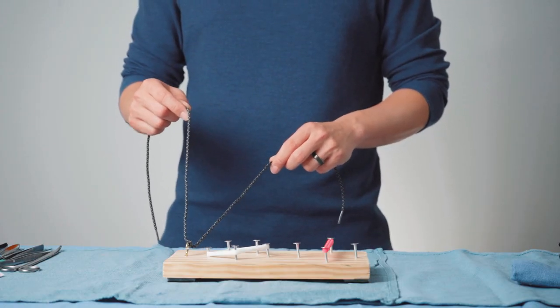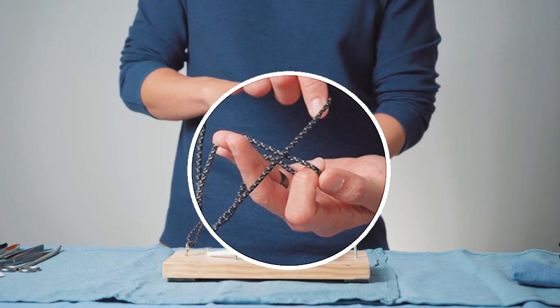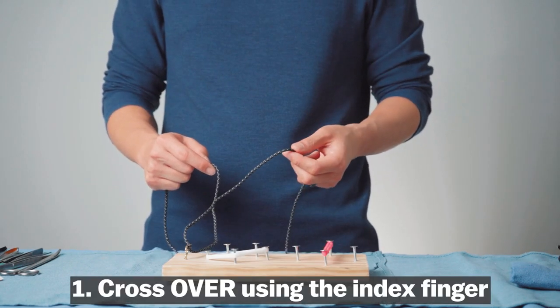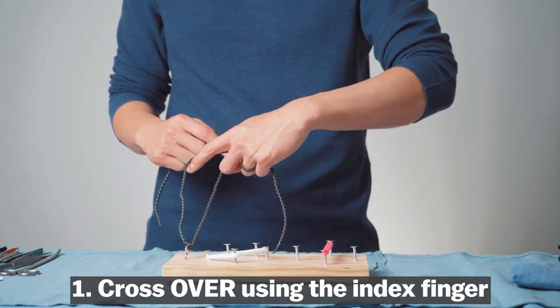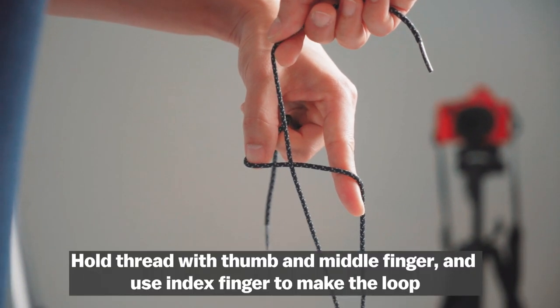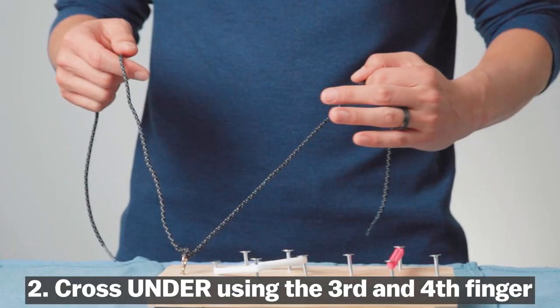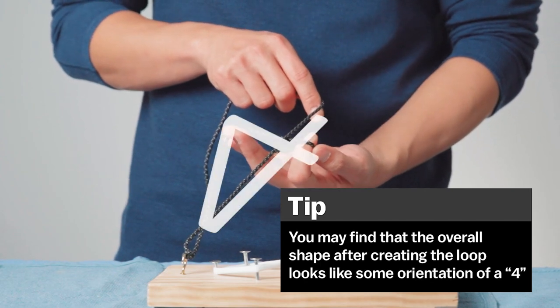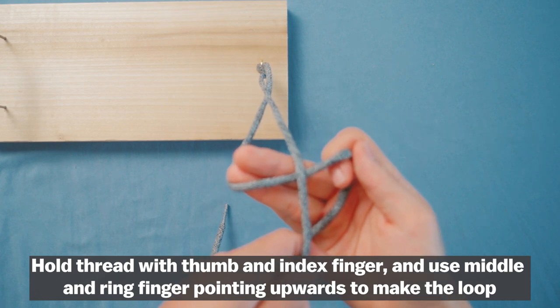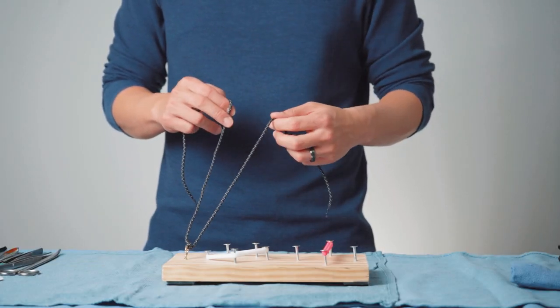When you're trying to create a loop, you need to understand that there has to be a crossing point between the two sutures. When you create this loop, these two threads have to cross. Now there are two main ways of creating that loop. One, you take your hand and come across the top and therefore use your index finger to pass through that loop. The other approach is to come from the bottom and then create a loop by using your third and fourth finger to come through that loop. In either approach, what you're doing is the same — you're just choosing to come from the top or the bottom using different fingers.